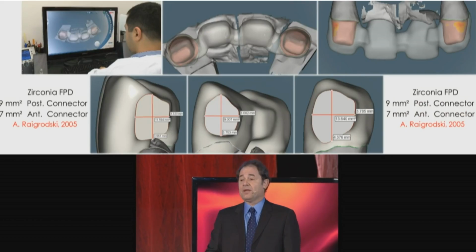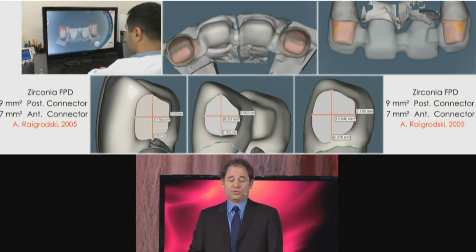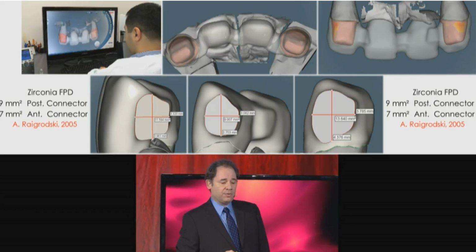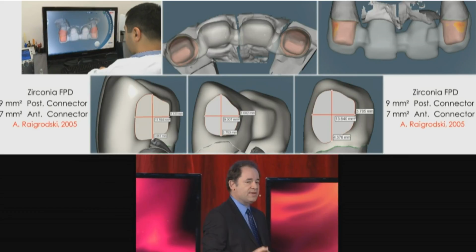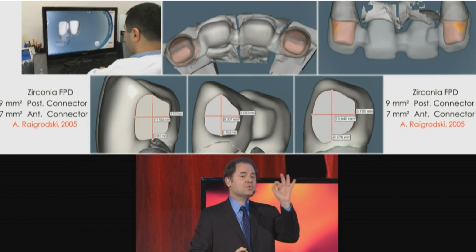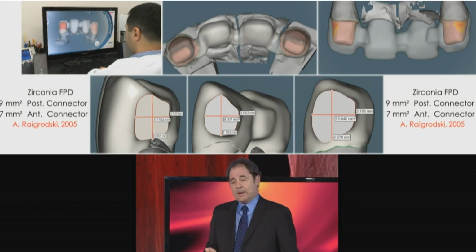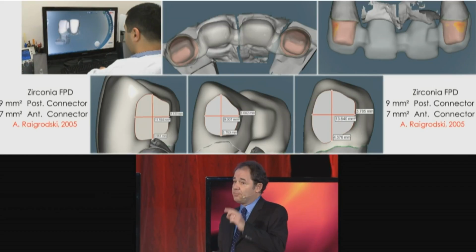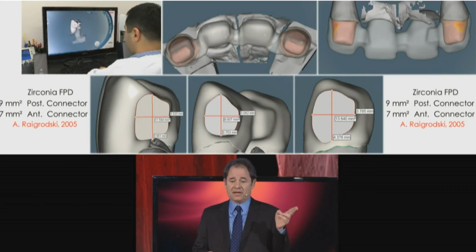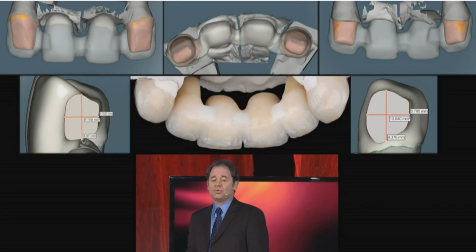So this is why our ceramist, Aram Tarosian here, decided to use zirconia. And the connector sizes I'm giving you are very well established with one pontic. So if I have one pontic in the anterior region, I need 7 square millimeters of zirconia, certainly more for lithium disilicate. But realize that those data are for one pontic. So for 2 pontics, how much do I need? It's unclear. I don't have any data. But you can tell we're trying to get a minimum of 9 square millimeters.